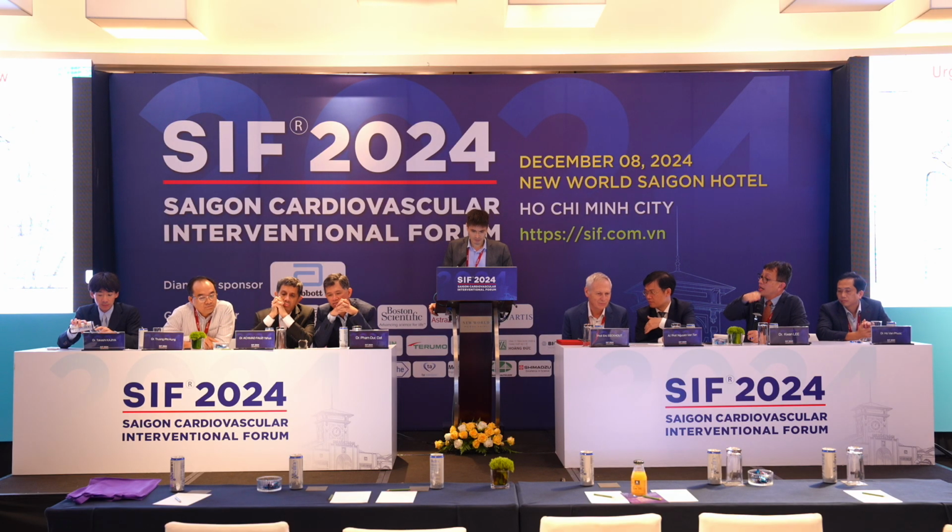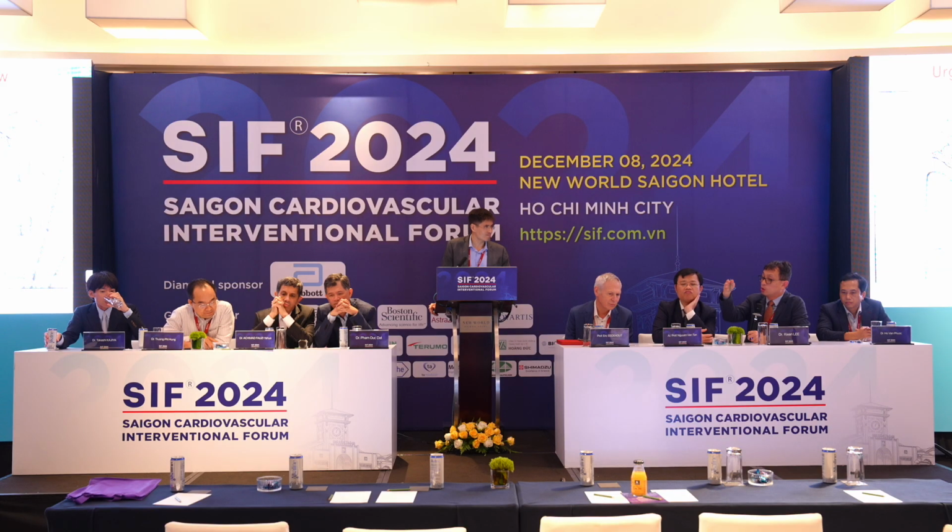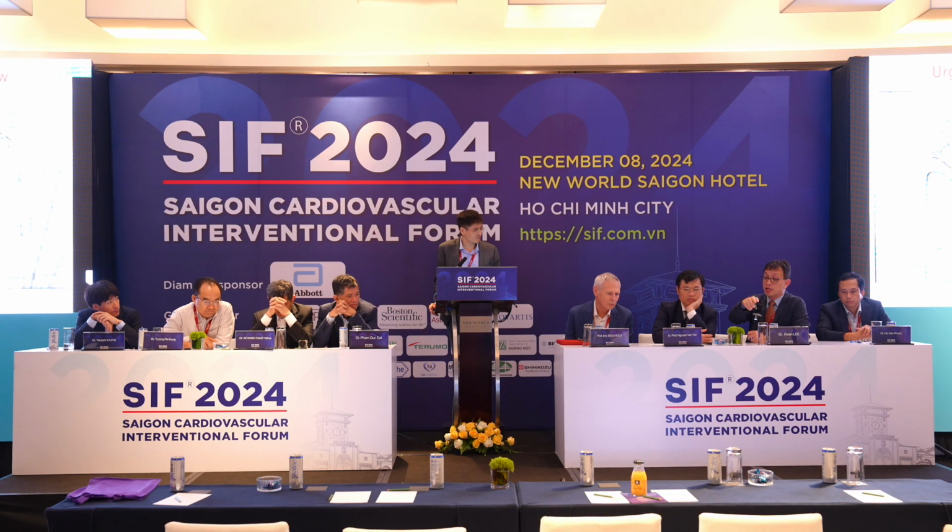If you put a right heart cath up and just draw a sat from the RA to the RV, you would see the shunting, and then you know straight away, right? Maybe you are right. The other way to tell is if you shoot this same picture in the LAO caudal projection. If it's really shunting into the left side, it will go left side. If it's going right side, it will go right side.